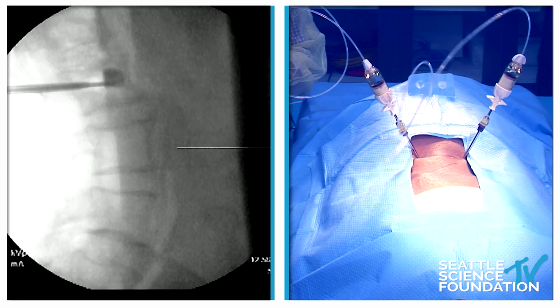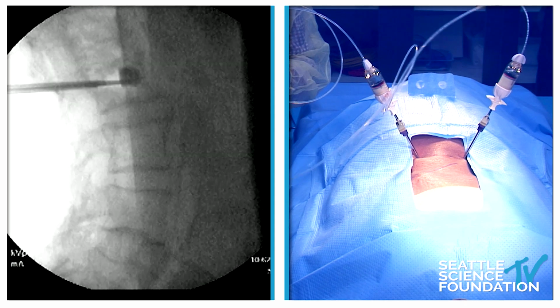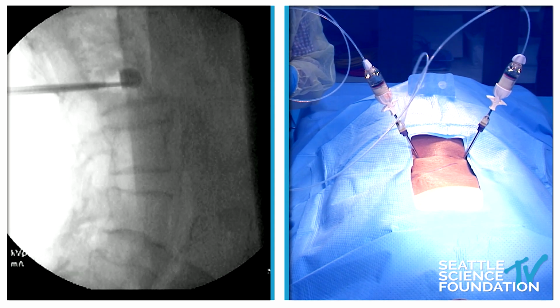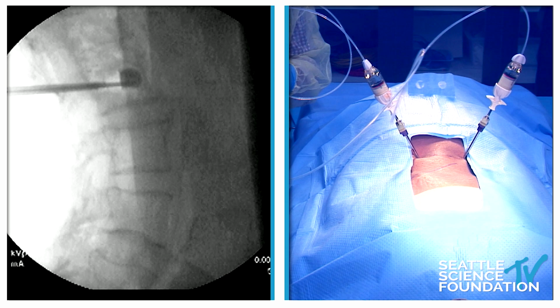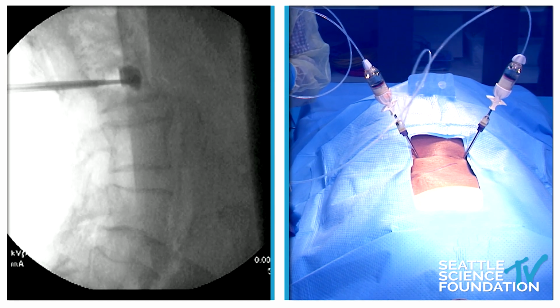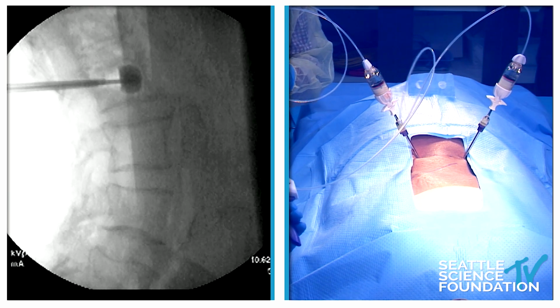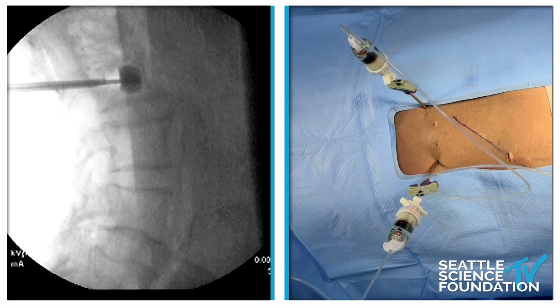And we're injecting one side. I just connected the second one, so I'm going to inject. An important take-home point of cement augmentation is do it in the lateral position. Yes. Because 1 out of 4 of the fractures will have a characteristic that will allow a leak to occur.